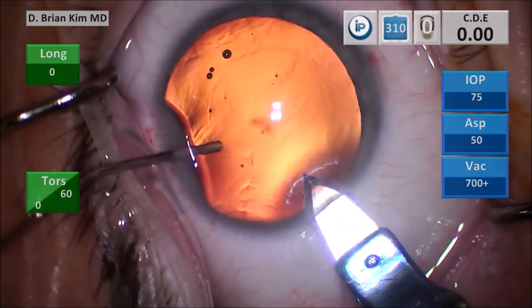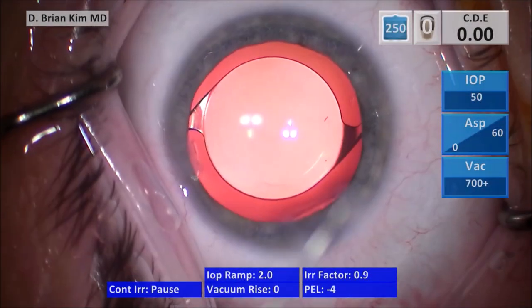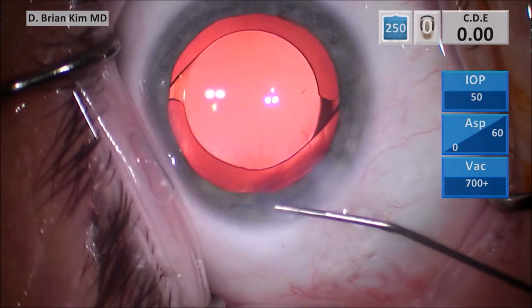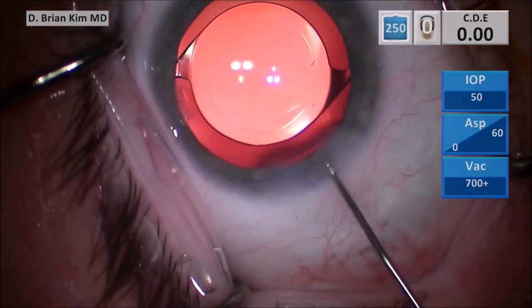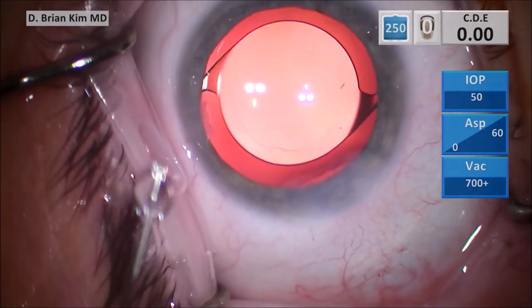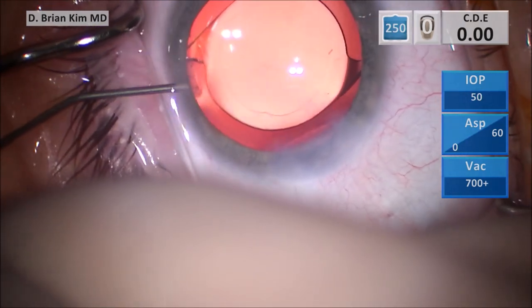After placing dispersive viscoelastic into the anterior chamber, I use the same cannula to help control the eye, being able to roll it up or down. I make my vertical groove, use a cannula to pull the eye away from me, place my blade into the groove of the incision. I tunnel and then dive down to create my triplanar corneal incision. After the case is completed, you want to hydrate the sides, then find an edge where there's stromal hydration and hydrate the roof, sweeping side to side.